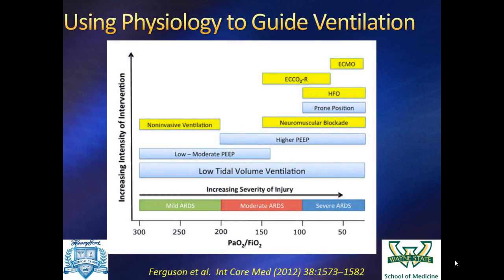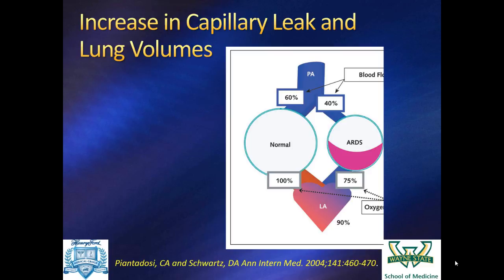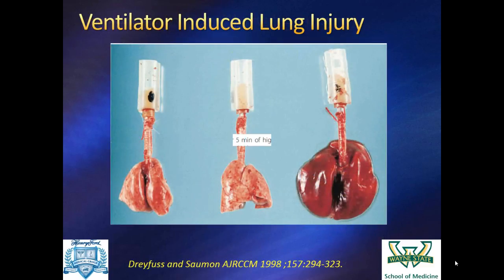So obviously the first part of the ventilator is this big piece that we all agree about, which is low tidal volume ventilation. And that is basically the idea that in ARDS, you have these parts of the lung that are flooded and you have less normal lungs, so you have a sort of baby lung, is the way we think about it, and that with that baby lung we want to use smaller tidal volumes, because if we don't, we run into problems like this.